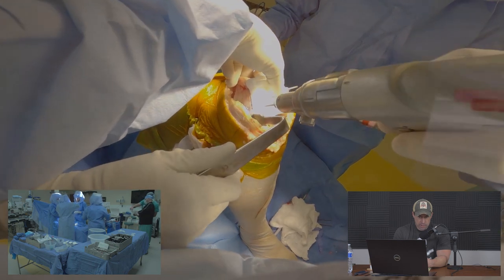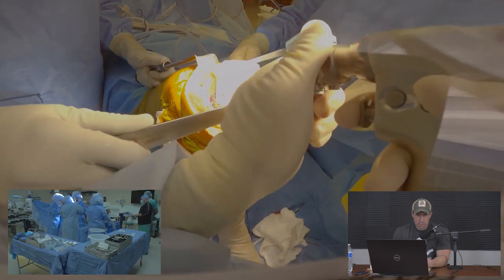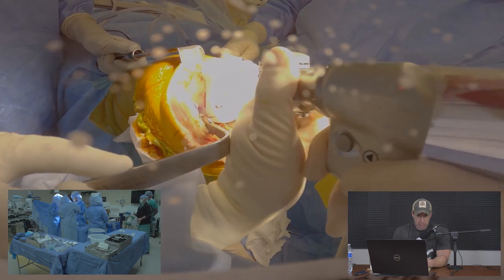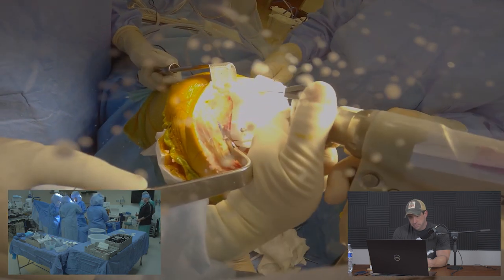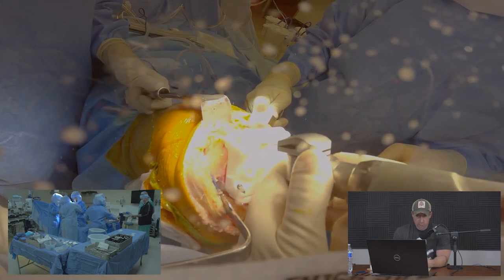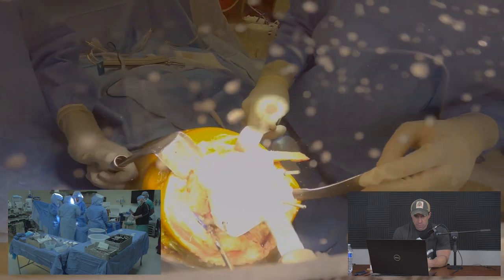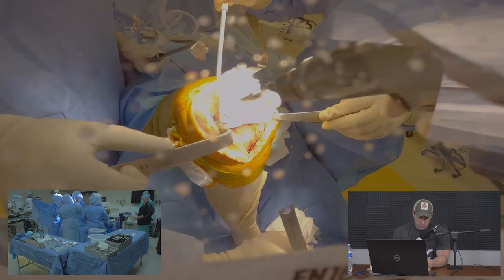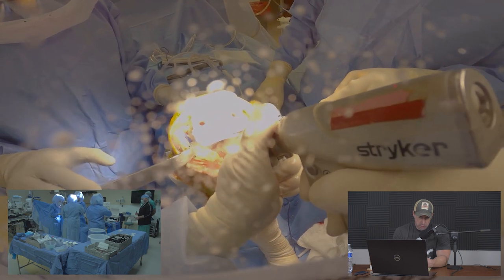Headed threaded pins are used to secure the F4 block to the bone; the smooth guide pins are then removed. We make additional cuts on the femur to shape the bone for the implant. These patient-specific guides are extremely accurate but we check carefully to match the bony surface. We also drill the lug holes for the implant and complete the posterior resection of the femur.